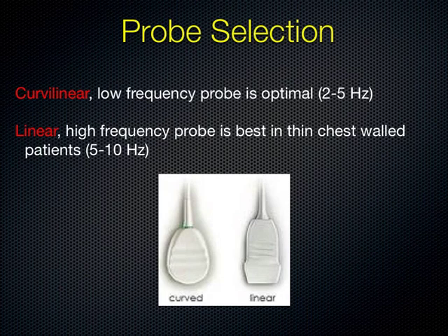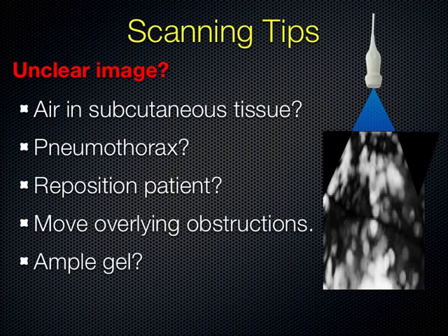Air is your enemy, gel is your friend. You've probably heard that 1,000 times, but it is absolutely true. If you don't have gel, or you don't have good contact with the chest wall, or if you've got something obstructing the way, like a bandage or a bra strap, you need to clear those things so that you can see.